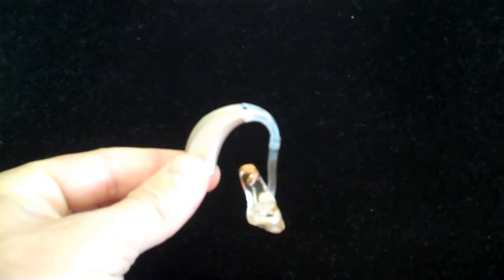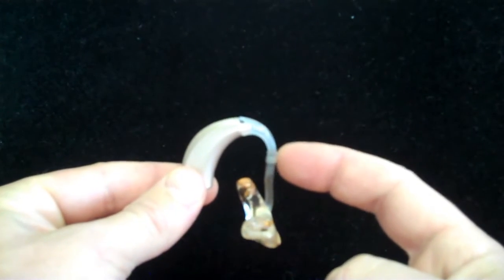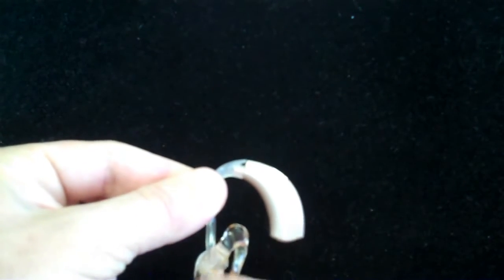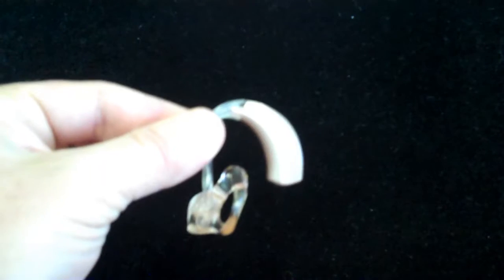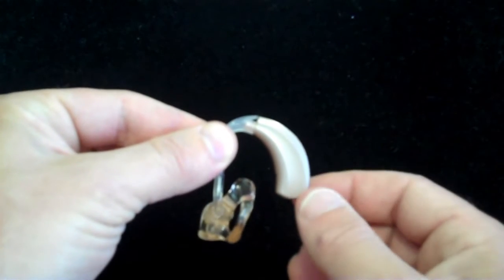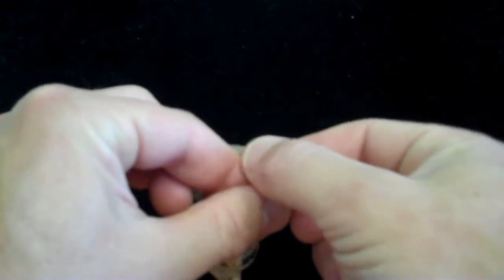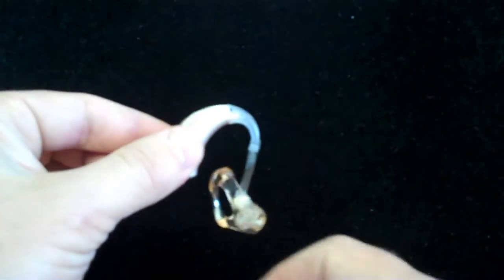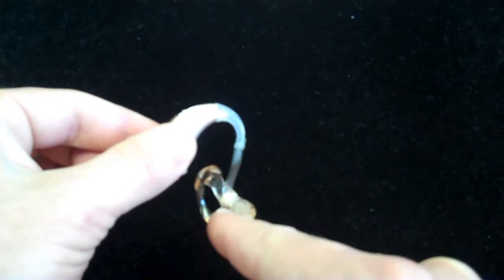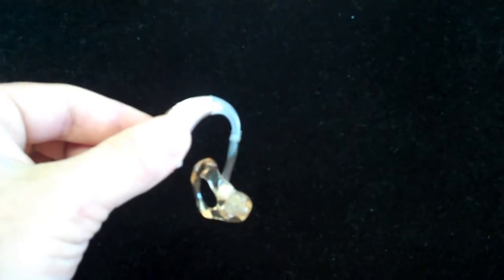So this represents a standard behind-the-ear hearing aid connected to a custom ear mold via this tube right here. The ear mold itself is made of silicone or acrylic, and it's custom molded to the ear specifically. The most important aspect when cleaning this style of hearing aid is keeping wax or debris in your ear canal out of the air passageway or the sound passageway in the custom earpiece.